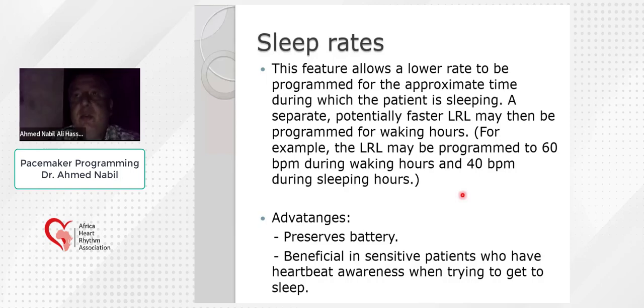I can adjust another rate for sleep, or during the sleep hours, to be more beneficial or more physiological, especially in sensitive patients who have this heartbeat awareness, because sometimes even the 70 beats per minute could be bothering for him.